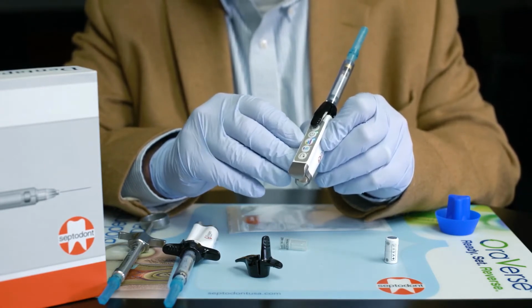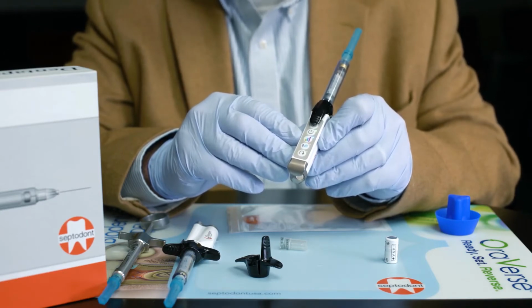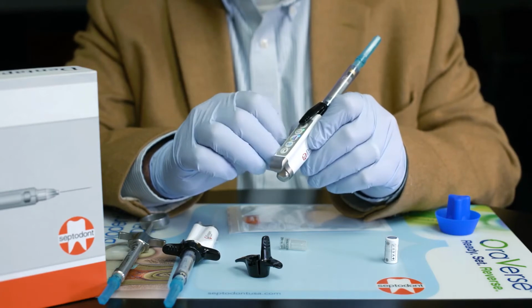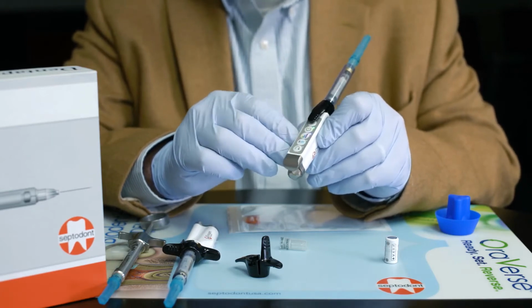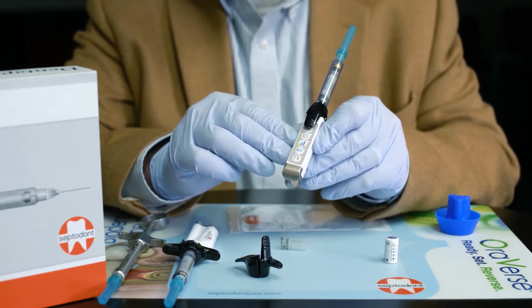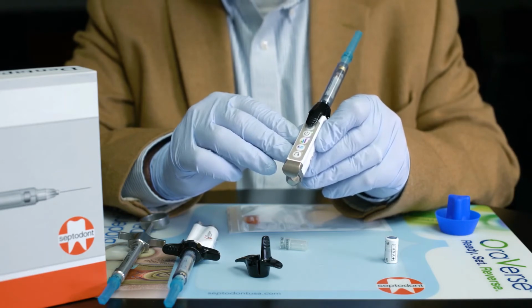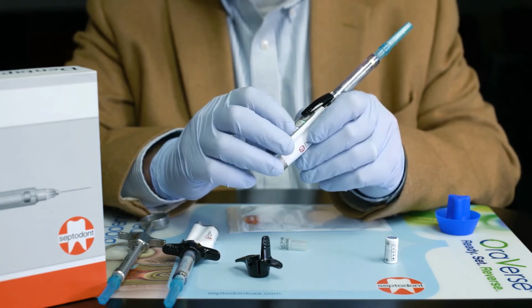It starts on the middle speed, which is blue. That will deliver 1 ml of anesthetic in 1 minute. That's the speed that's recommended by most experts. Purple is the fastest speed. That will deliver 1 ml in 30 seconds, which is twice as slow as the standard dental injections that most dentists give. And again, slow is more comfortable.